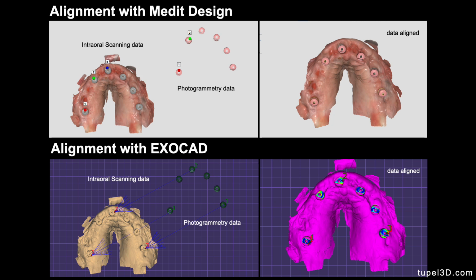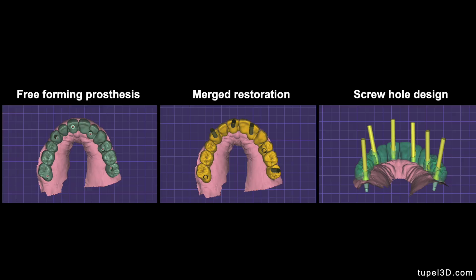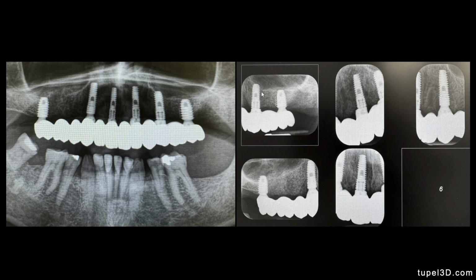That's quite easy. Next you have to detect the implant position, and then proceed with the design of the definitive prosthesis. This is the case completed with a zirconium bridge, titanium reinforced, and you can see here from the control x-rays an excellent passivity of the prosthesis. There are no gaps, and clinically the feel is that the bridge itself is very passive.